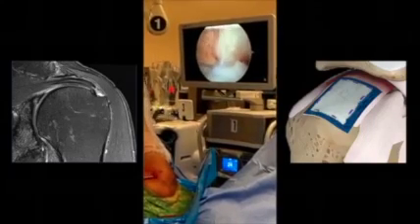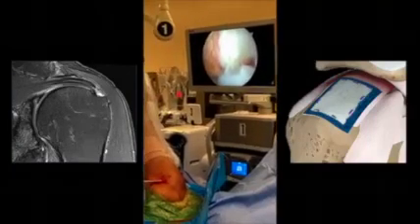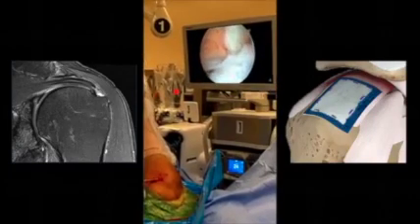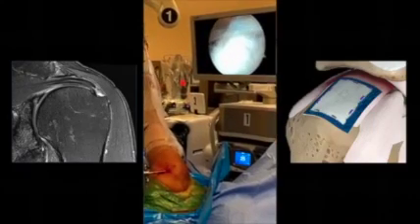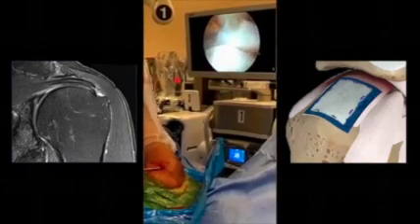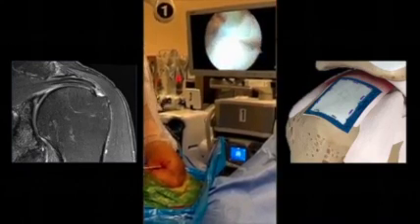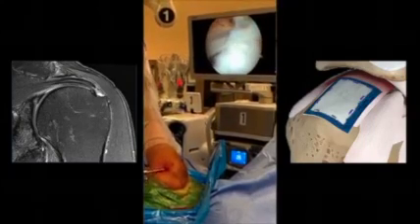And check this out. Here's the back half of the CA ligament right here. And you can see there's significant abrasion on the back half of that ligament. And then as I scroll in here, look at the high-grade partial tear of the rotator cuff. This is on the bursal side. You can see as you sort of roll in here, every time she's moving her arm like this creates a significant pain syndrome. So, what are your treatment options for this?